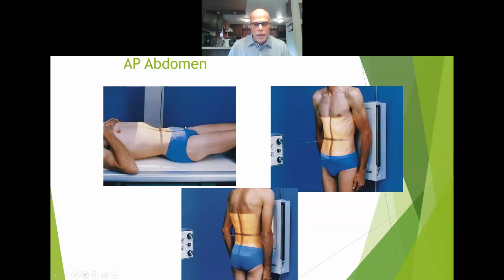You can palpate right here on his side, on his hip, and you'll feel the greater trochanter. And when you feel that, that's where you're going to put the bottom of your light to ensure that you get the bladder. You can do the same thing here. You can still palpate there, or you can ask the person, your patient, to press right there, right above the bladder. Everyone knows where the bladder is, and there's a little hard spot, and that is the upper margin of the pubic symphysis, or you can go with the femoral greater trochanter, but if you're trying to include the bottom of the bladder, you need the upper margin of the pubic symphysis.